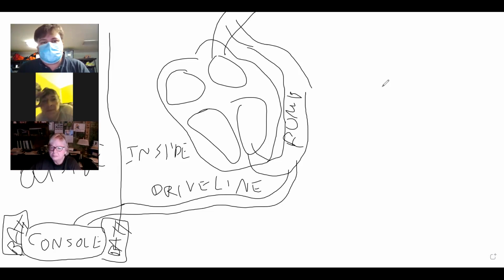And if the answer for this VAD is not cardiovascular, then you should continue with routine patient care as you normally would in the field, with the exception of remembering to take the batteries, the extra charging station, and the extra console with you. Did I mention that you should take the batteries with you if you transport the patient, as well as the charging station and the console? Okay. The one thing that is going to be an absolute screw up is if that doesn't happen.